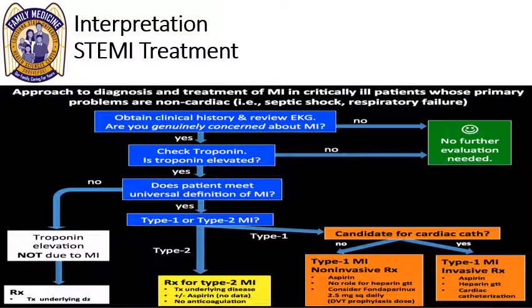So how do we treat it? All right, so if you have a good history and you review the 12 lead and it says this is a good MI, you get the troponin, and then obviously the most important step that they miss right here is the 12 lead.